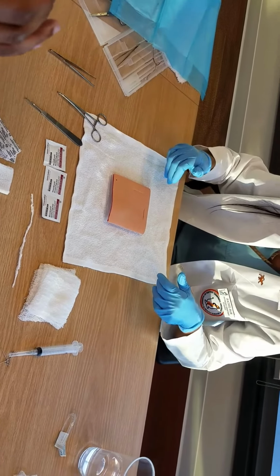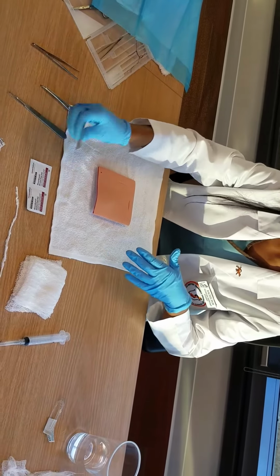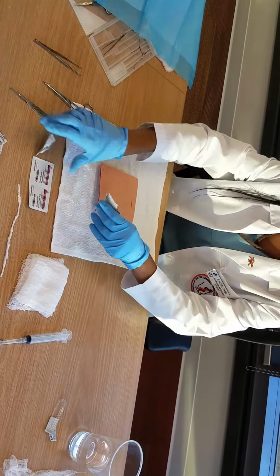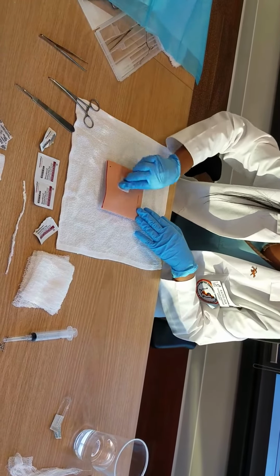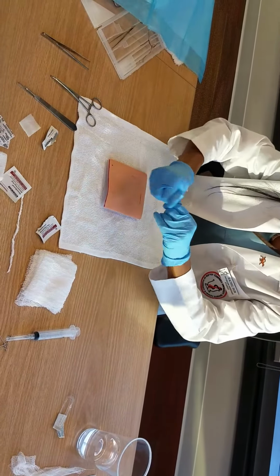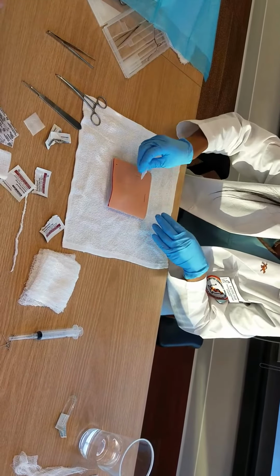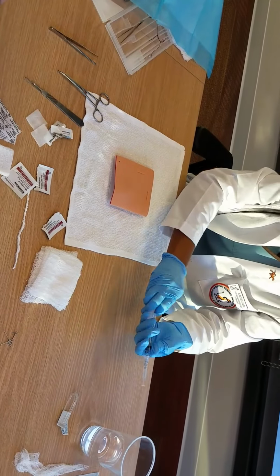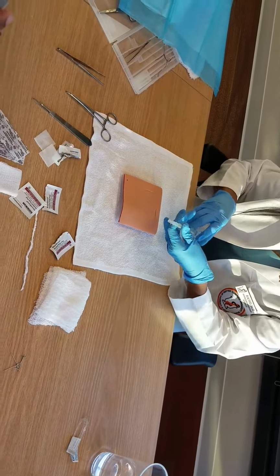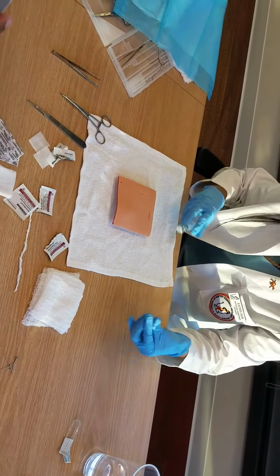Alright, so we want to apply a single layer of betadine, or in this case I have alcohol wipes, on the abscess here. And then you want to use a regional field block approximately 1 centimeter away from the erythematous border of the abscess around the perimeter. So I am using lidocaine, about 5 mLs, and I'll go ahead and do the field block.